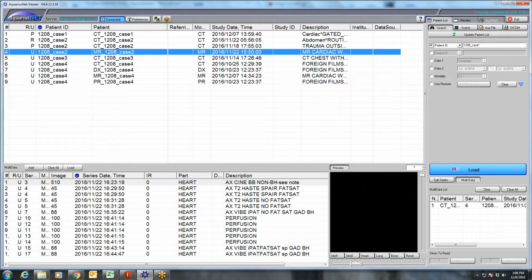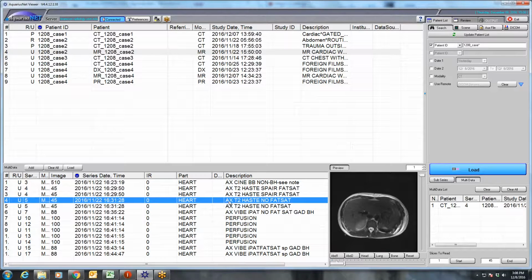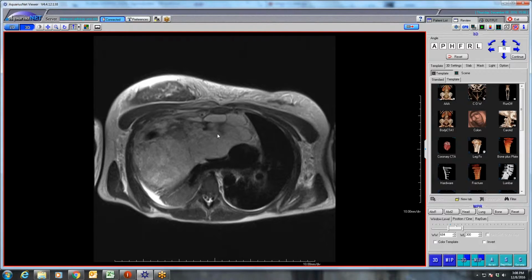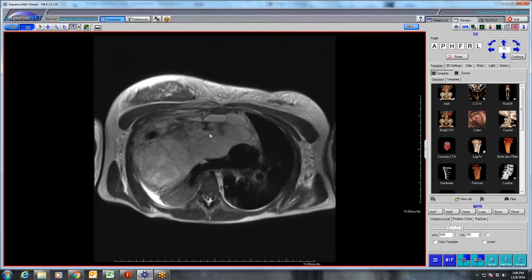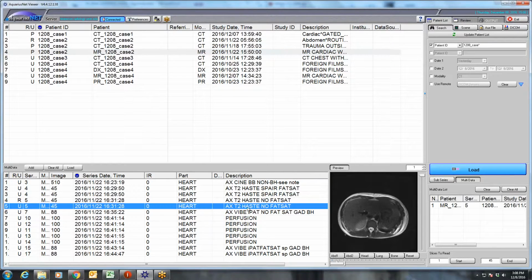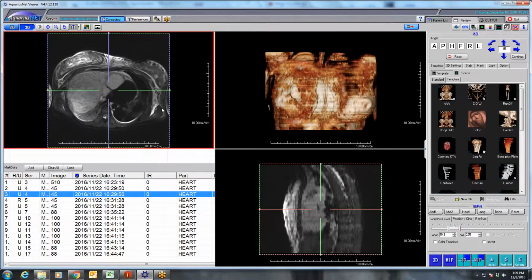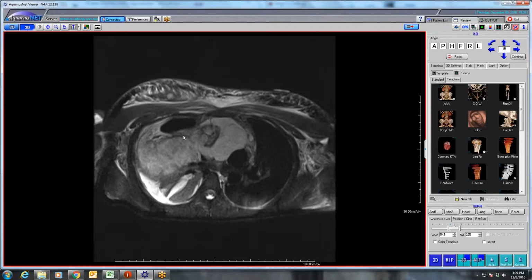And then they got an MRI, which I won't beat down. There's all these images, which I'll send. But this is a T2 weighted sequence, and this is not a simple cyst. It's multiloculated. There's some soft tissue component here. And there was a question, when we did the fat sat, it didn't really saturate out for me. There was a questionable amount of saturation in this area, but this was pretty dark on the non-fat sat as well, this area up here.